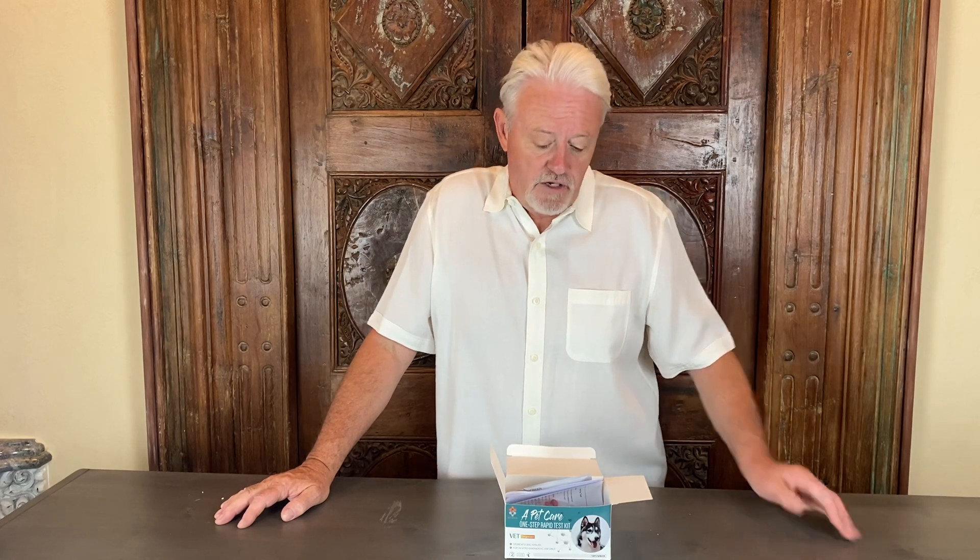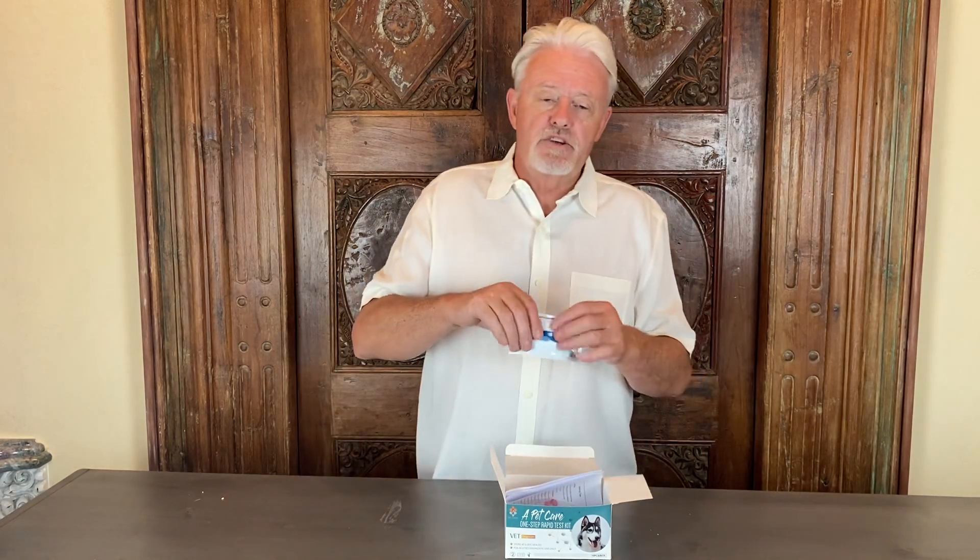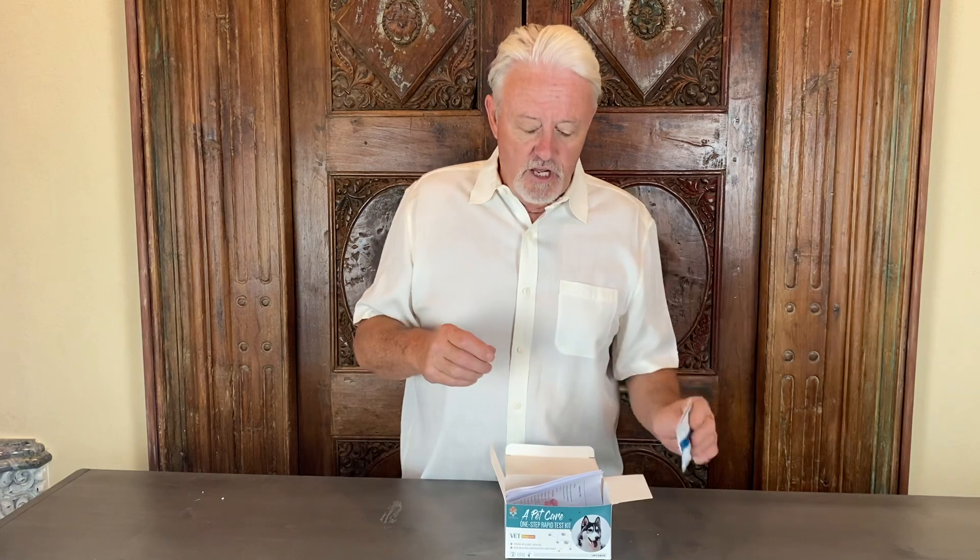So why would you use these? The pregnancy test you can do up to 30 days after AI to see if your dog is pregnant. There are two lines on the test that show you whether the dog is pregnant or not.